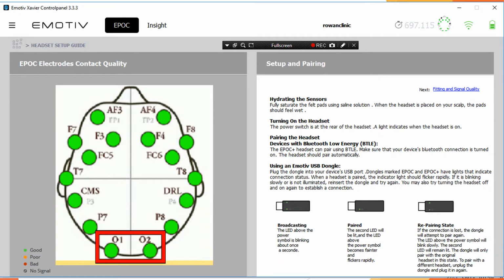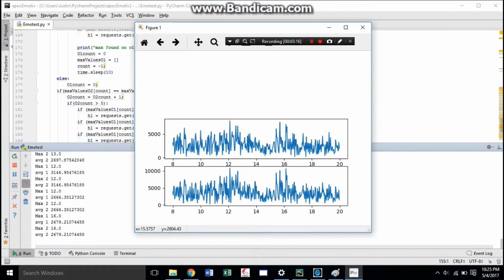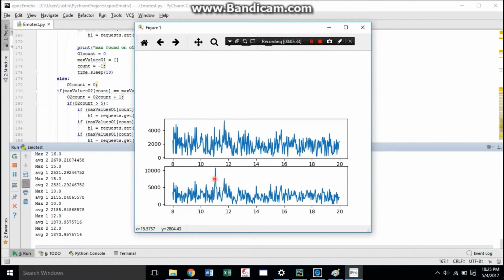When the user focuses on a flashing light source, the frequency at which the light flashes is mirrored in the occipital lobe. Here's an example of that in video. So by measuring the brain activity in the region and performing a Fourier transform on the signal data, we are able to determine the frequency of the light source the user was looking at. This is an example of the initial graphing we did. The user was staring at an 11 Hz light source, which was the frequency we obtained.